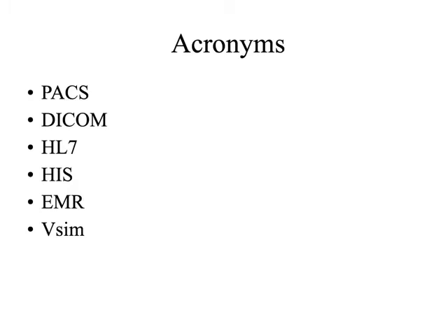And what format does it use? It uses a DICOM format. So this is the format for sending images, DICOM is. I think it means digital image communication in medicine, or I don't know. Okay, how N became an O, I don't know, but yeah, I think that's right. Is a DICOM, digital communication.